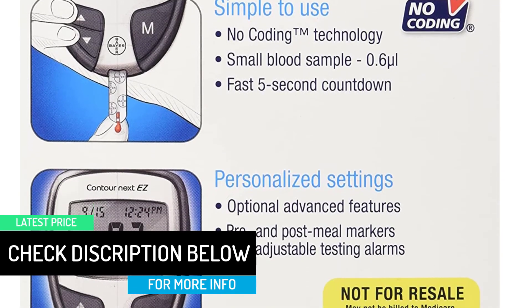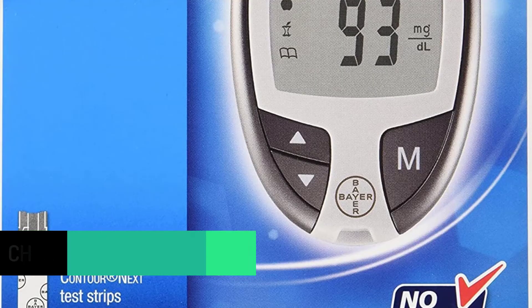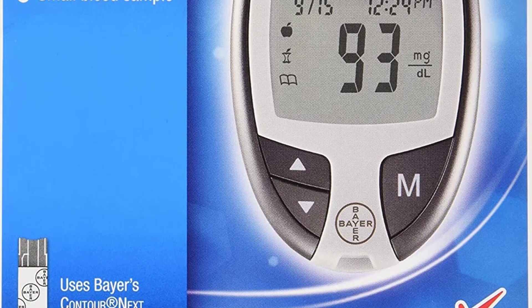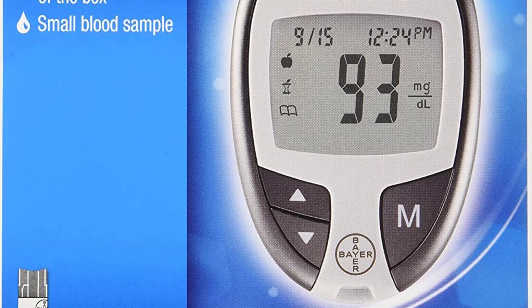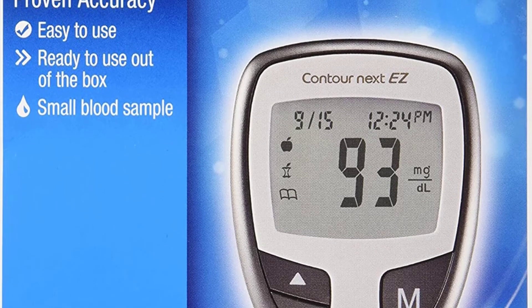Only using a small blood sample, this device will help you identify trouble spots in your blood that have high and low target ranges. With a fast 5-second countdown, you will be able to read your blood glucose levels almost instantly with the Bayer Contour Next Easy Blood Glucose Monitoring Kit.